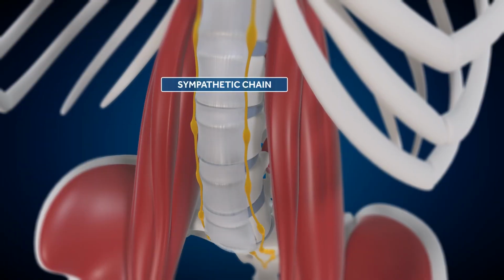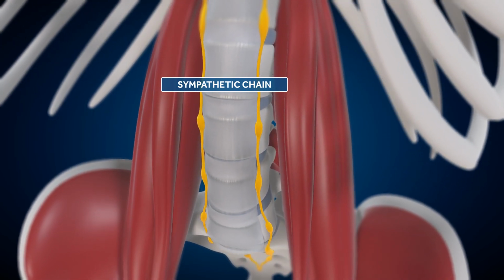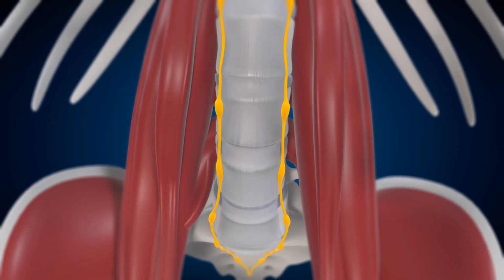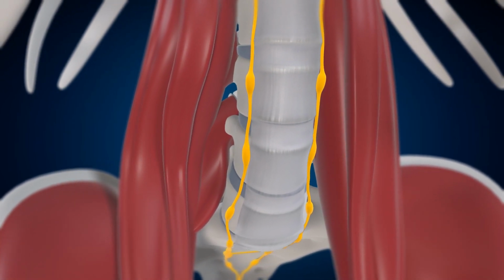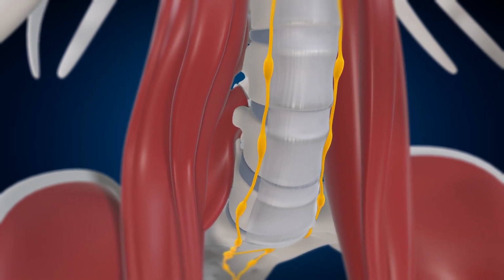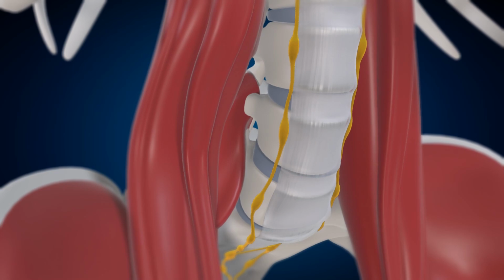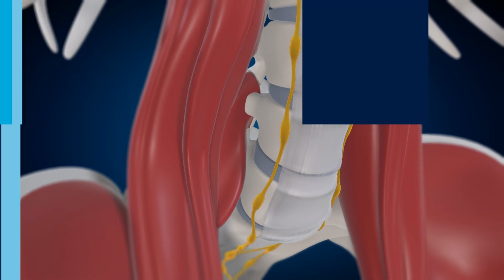The sympathetic chain consists of ganglia on both sides of the spine and may be injured when approaching obliquely. If visualized, the sympathetic chain may be moved anteriorly using a blunt dilator or Kittner to move soft tissue from the anterior psoas to the ALL. A small percentage of patients may experience transient lower extremity symptoms, such as leg warmness and swelling of the left leg if the chain is injured.